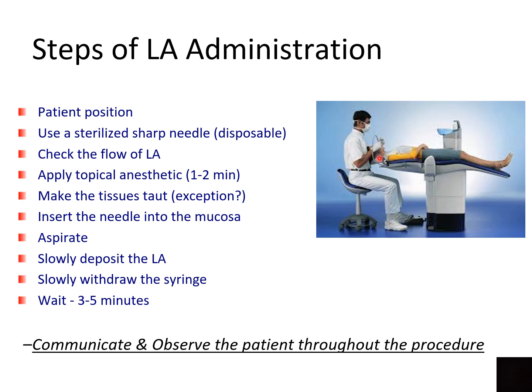Please ensure that for all LA injections, you use the supine position. And when we have face-to-face sessions, I can elaborate further on this. Secondly, of course, like almost everything in dentistry now, use a sterilized needle, which is single use.